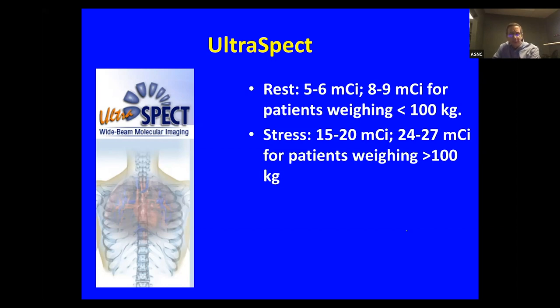And the other times we will tend to PET is if it's going to be pharmacologic stress anyway, and we have a choice. If it's going to be pharmacologic stress and there have been previous discordant SPECT and cath results, for example, those are the major categories.